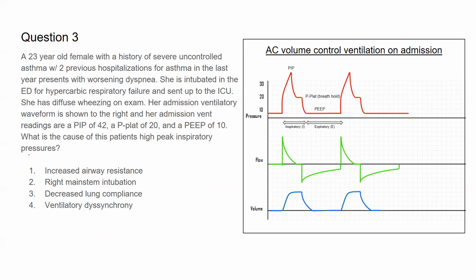Danielle, I think with our next question we're going to get into normal airway resistance, and we're going to get into normal plateau pressures as well. So I'm going to answer that. Normal airway resistance, which is when you make flow a constant, airway resistance, AR, equals your PIP, your peak inspiratory pressure, minus your plateau pressure. And it should be less than 10.